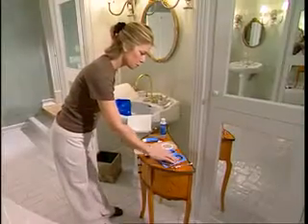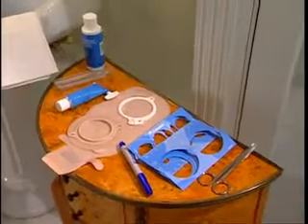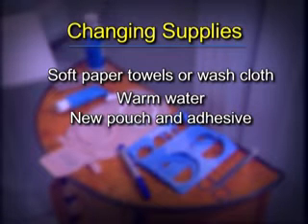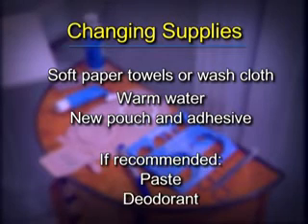When changing your pouch, make sure all of your supplies are within reach. These may include soft paper towels or a washcloth, warm water, a new pouch and adhesive, and if recommended by your ostomy nurse, paste and pouch deodorant.